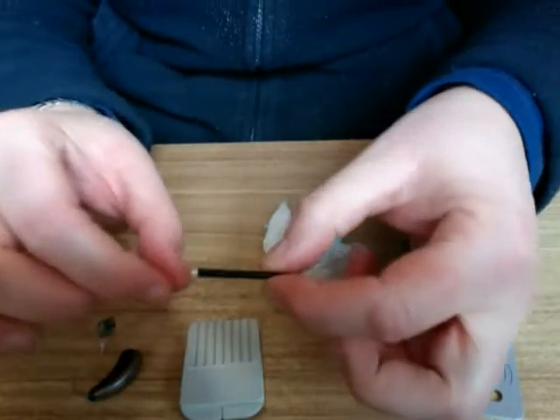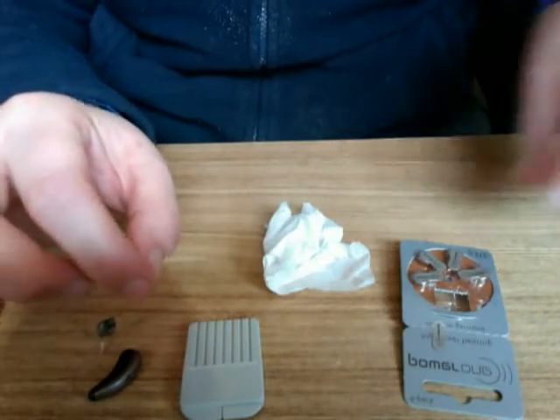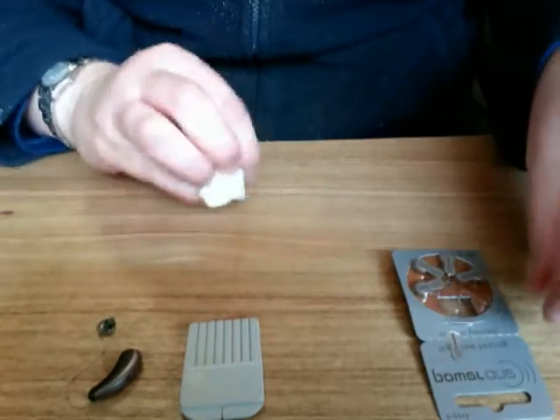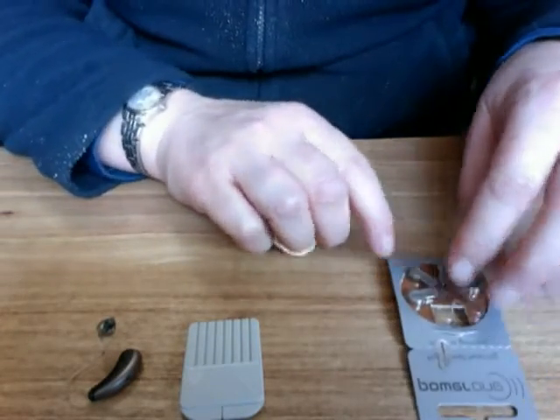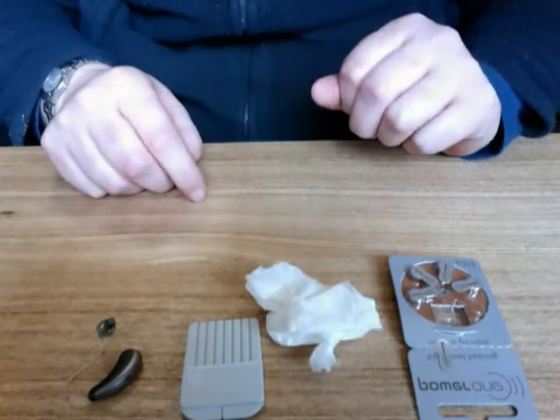Make sure you throw away the filter that's been replaced so it doesn't get used again in the future. Another hint is to put the sticker from the battery onto your calendar to make sure you know when the battery needs replacement.